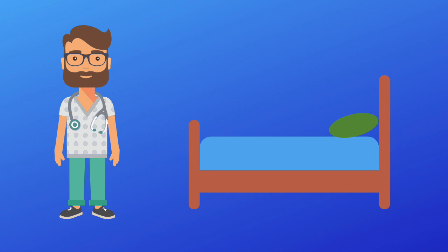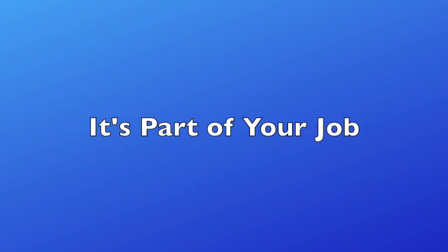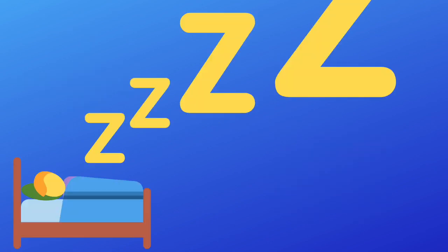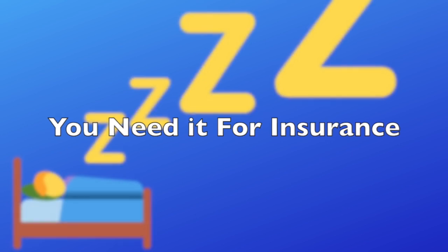Does anyone need to see my sleep data? This feature is important usually for 3 reasons. 1. Your doctor wants to monitor how you are sleeping and may need to adjust your settings for you. 2. Your job legally requires you to hand in sleep data. Pilots, truckers, I'm looking at you. 3. Your insurance wants to make sure you are using your machine.